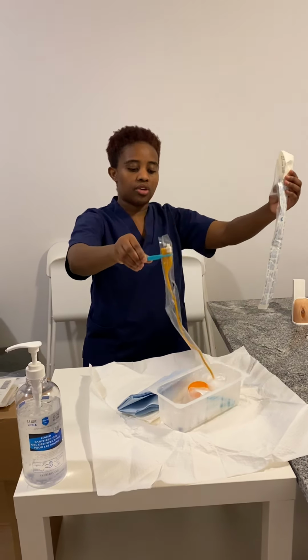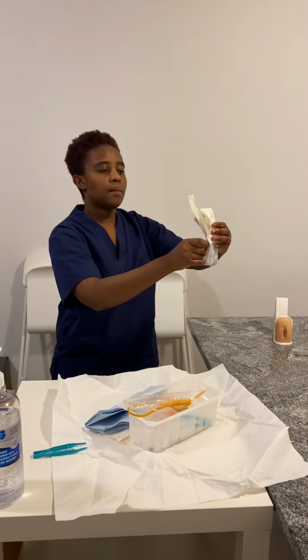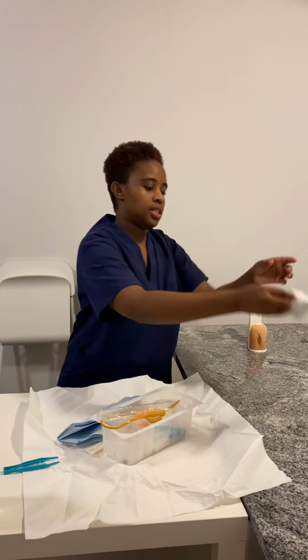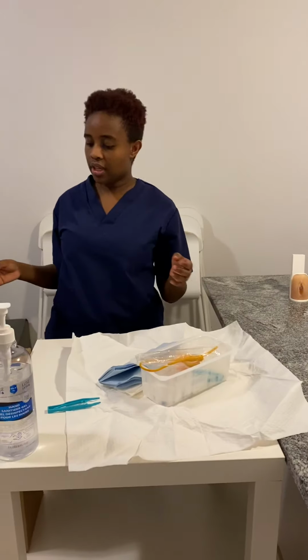And then I'll add it on my tray. And I'm going to put it here. And then now I'm going to put on my sterile gloves.